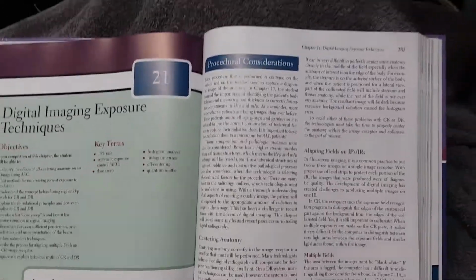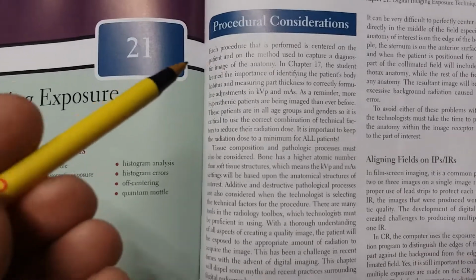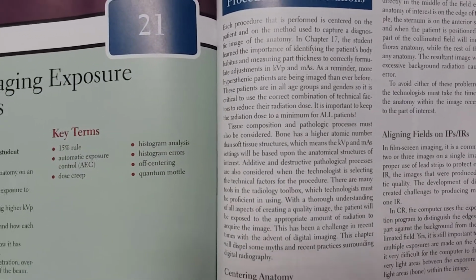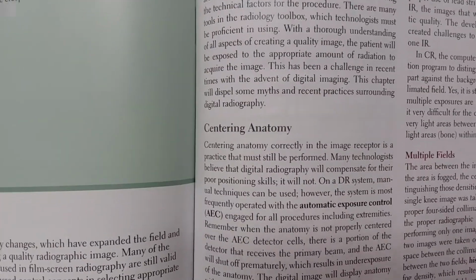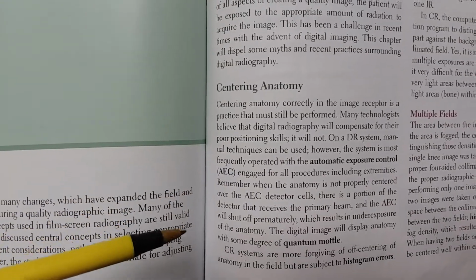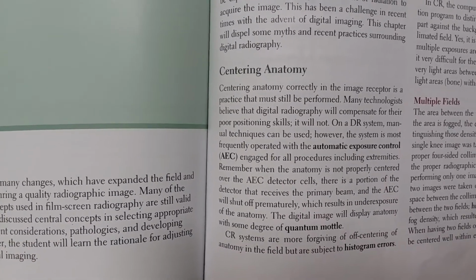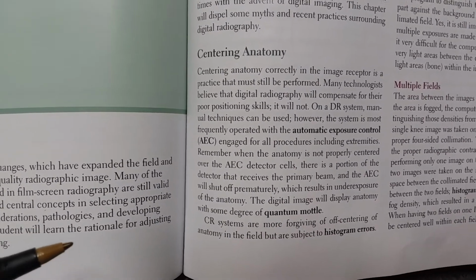But here on page 281, procedural considerations. First of all, it's just telling you that it's still just as important to set your technique, which is kV and mAs, in digital imaging as it was in film screen imaging. And the first thing it talks about is centering anatomy. We see here that, especially when using automatic exposure control or AEC, it's very important to position the anatomy over the correct photo timing cell, as we learned back in chapters 17 and 18.